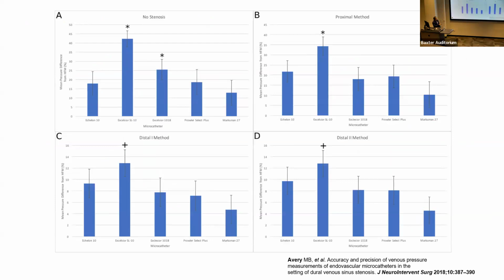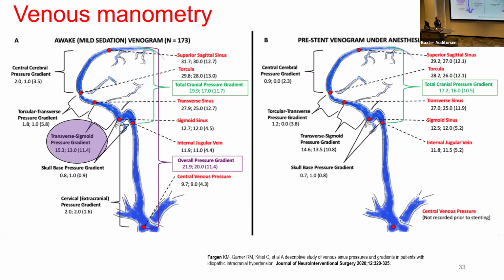These are different catheters that we use, but it is basically the same as measuring ICP. When you have an EVD and you connect it, same thing, or like a central line and you measure pressure. So basically, you get the catheter either from the arm or from the groin. You go to the place that you want, and then you connect to this monitor, and you have a wave on the monitor, and you have a number. These pressures are usually in millimeters of mercury.